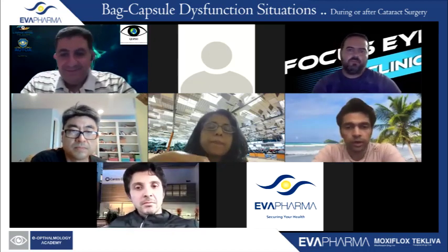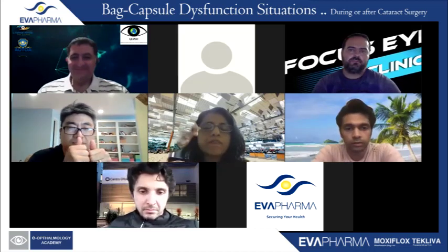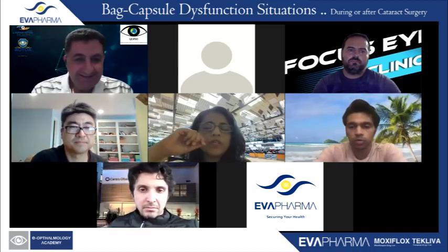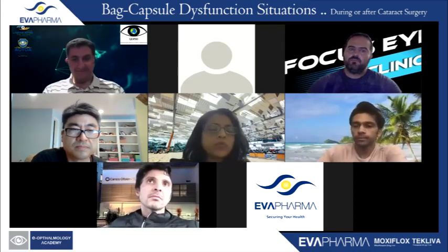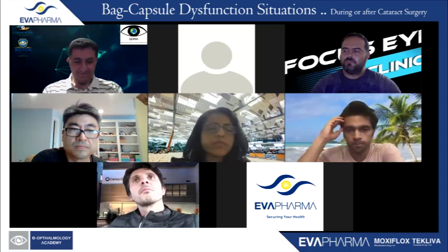Perfect. Brian, thank you so much for that great... I have one more question. Brian, do you find that the haptics kink when you do the intraocular maneuvers, or is it just simple?